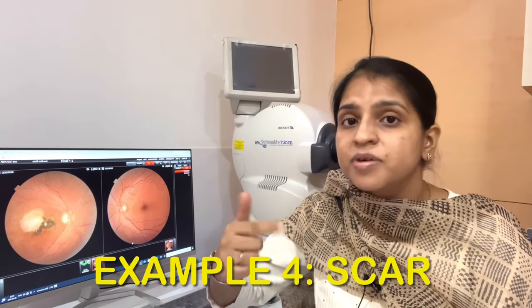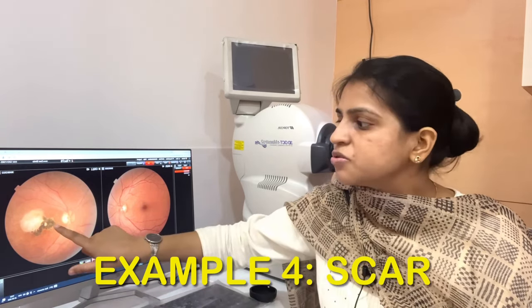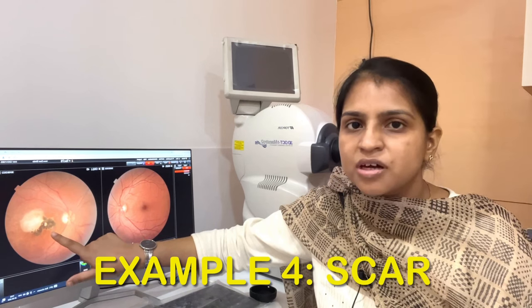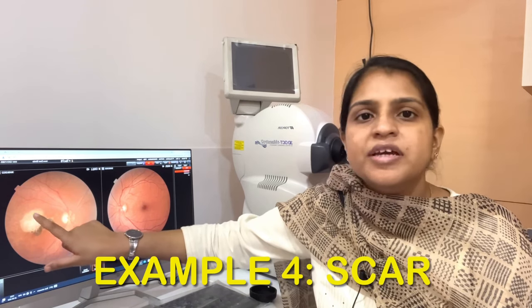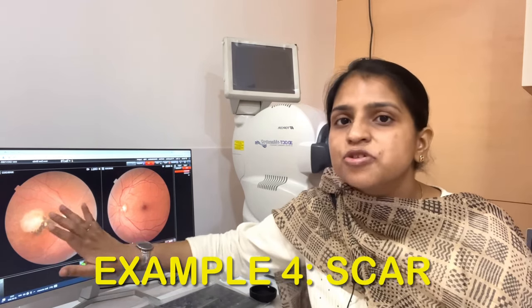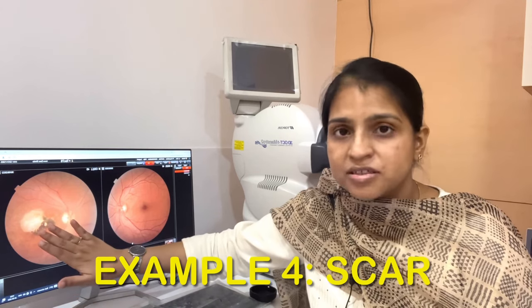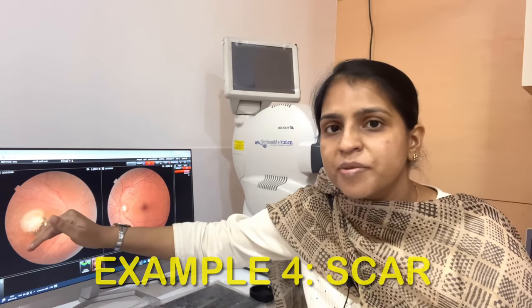This is the first time we talked about the scar increasing. The last time the patient came, there was a scar — and you can see a scar. But within the scar, a new scar has formed. So we can compare what the first situation was and where the new scar is coming from.